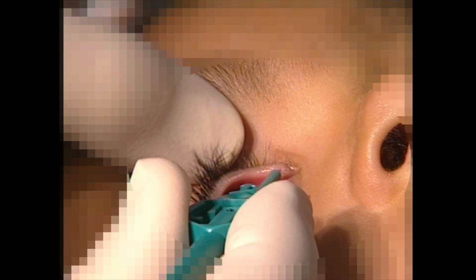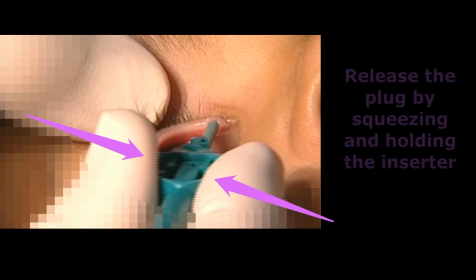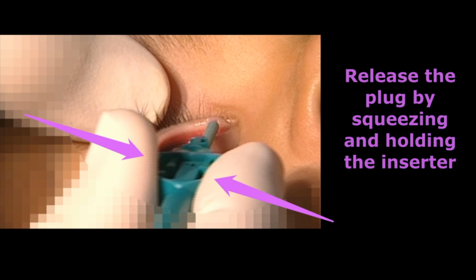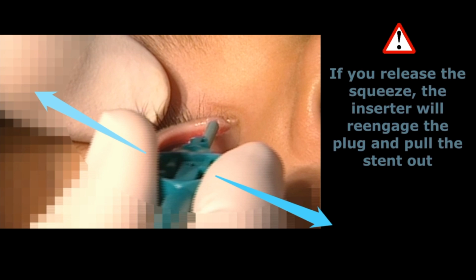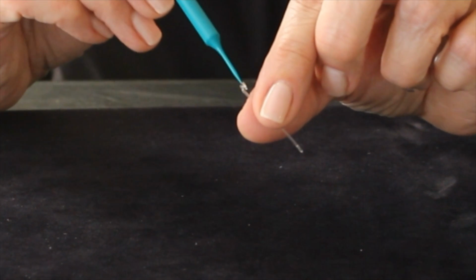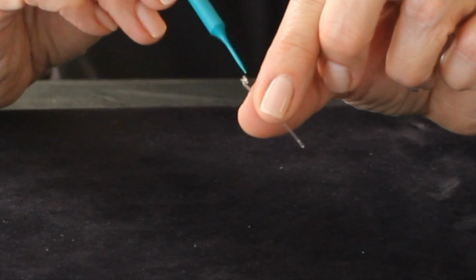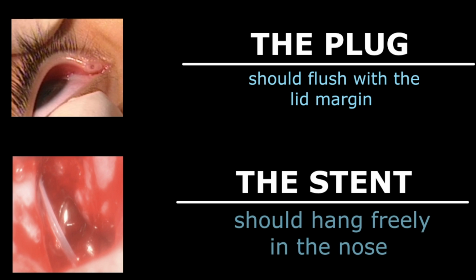In other words, engage the plug of the Masterka on the green inserter, push the Masterka plug into the punctum, and once seated, release it from the inserter by squeezing and holding the inserter as it is withdrawn. If you release the squeeze, it will cause the inserter to re-engage the plug and pull the stent out. It is common for a surgeon to use the dilator end of the inserter to seat the plug as well, as it seats very easily. The plug should rest flush with the lid margin. The stent should hang freely in the nose.